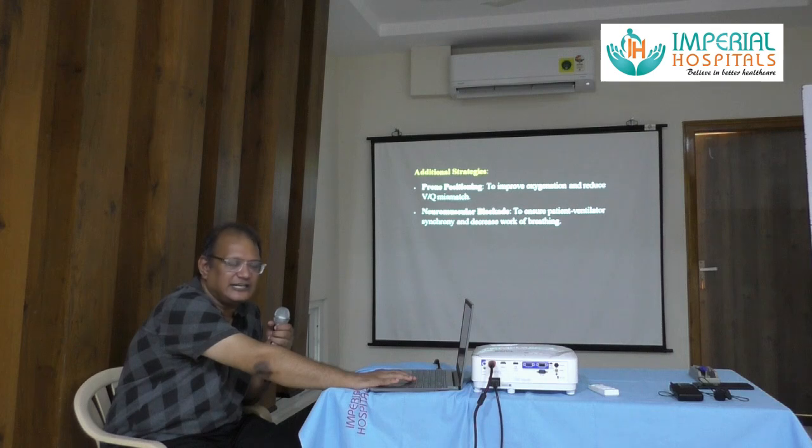In ARDS patients, additional strategies that can be used in a ventilated patient are prone positioning to improve oxygenation and reduce VQ mismatch, ventilation perfusion mismatch, and neuromuscular blockade to decrease the work of breathing so that the ventilator will take over the work of breathing.